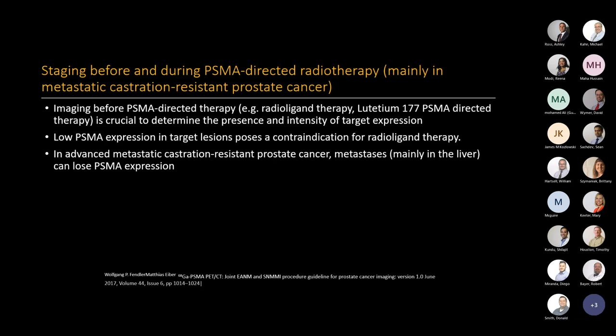If we start seeing patients living longer with better treatment, eventually PSMA imaging may lose the receptor sensitivity. I'm thinking it is similar to our iodine imaging. At the beginning, the cancer might be so sensitive to iodine, but eventually they may lose their differentiation for iodine. So maybe eventually we will start seeing this too.